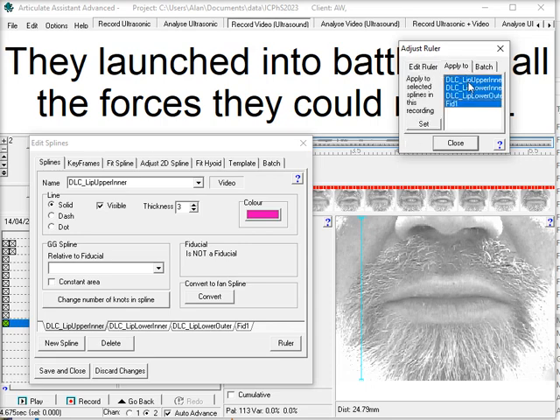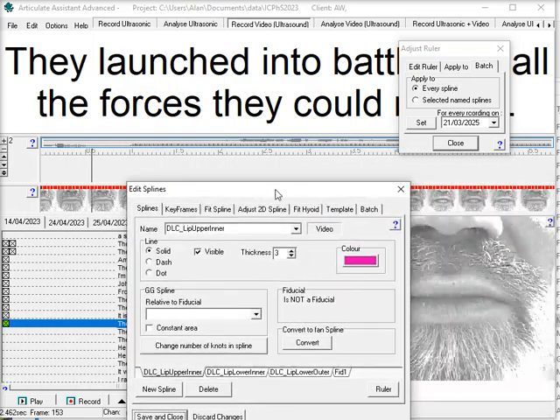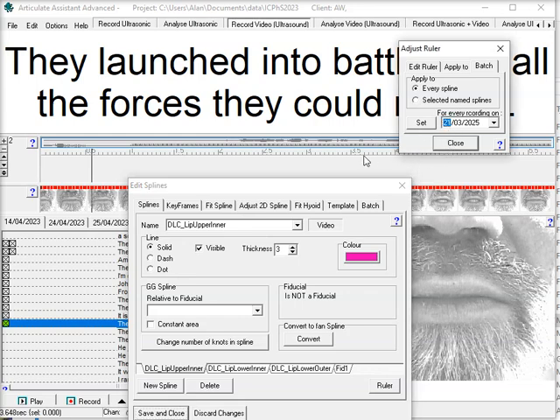Now you can just apply this to individual splines or to all the splines in the current recording, but what we're going to want to do is to apply this scaling to every spline in the whole session. So we'll click this every spline, and this session was recorded here on 14/04/2023, so we'll change this date to 14/04/2023 and click set.